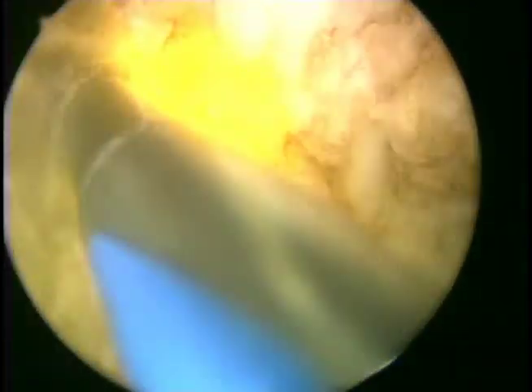As you can see here, although a very small prostate measured at 40 grams, most people doing any laser surgeries can appreciate that this is a very dense prostate. Occasionally, we vaporize and it's like cotton candy. It just melts away. In this instance, particularly on the floor in that left lateral lobe, very dense stromal tissue, and just requires, again, more patience, undermining and vaporization, as well as this idea of tissue removal are what is needed to get a nice, clean floor for proper healing.